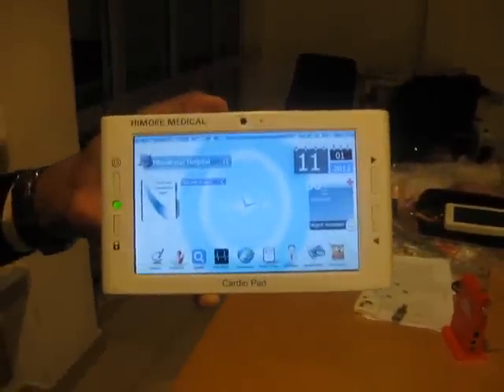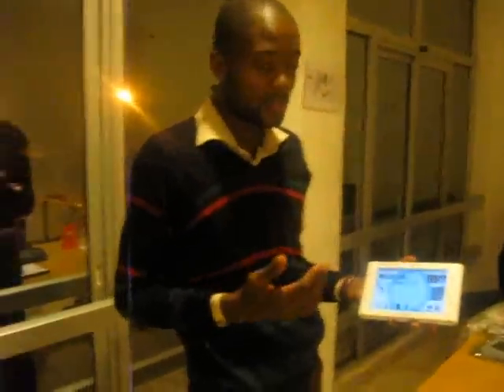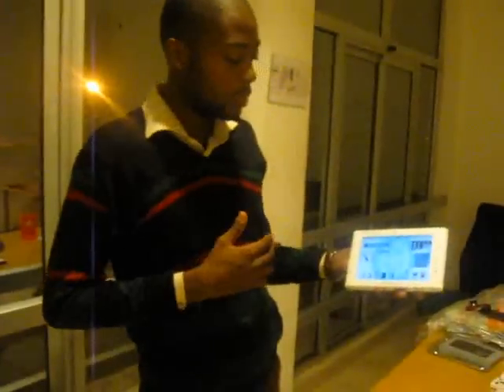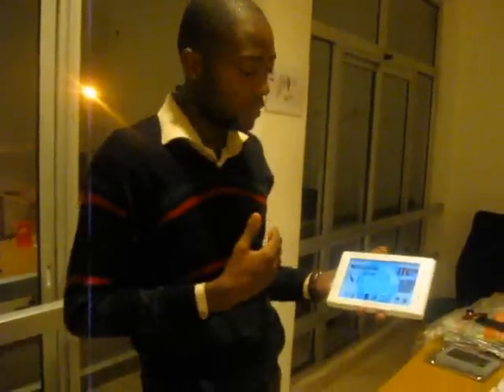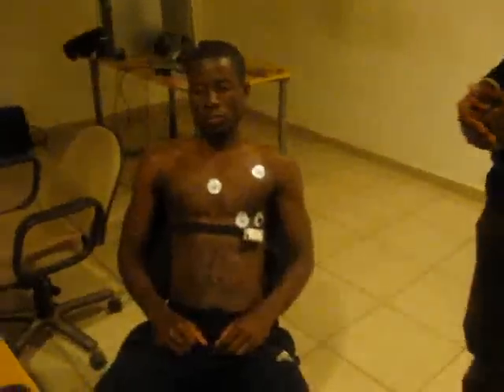Now I will show you the process of how to perform an ECG examination for a patient and how the whole system will allow producing a remote diagnosis using data transmission. Suppose we have a patient in a district hospital situated in a small village very far from the city where there is no cardiologist.